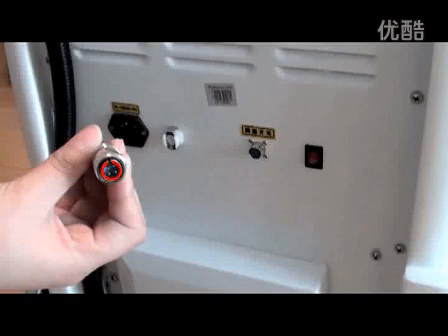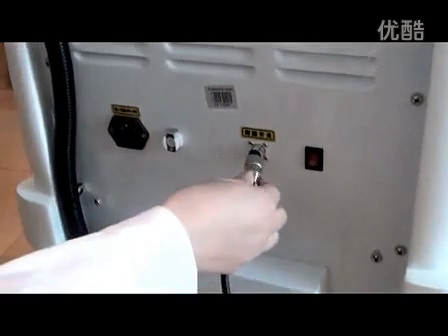Step 2: Installation of the foot switch. Keep the small gap upward and insert the connector, then push it inward mildly and screw it tightly.